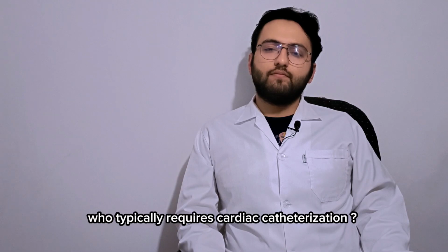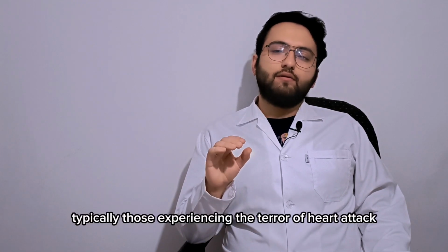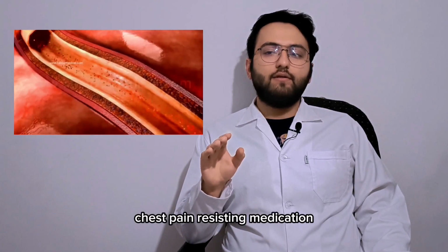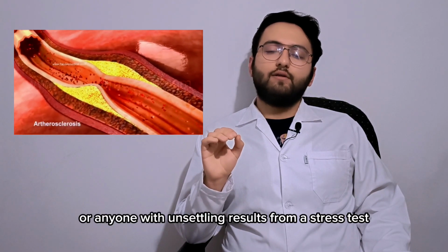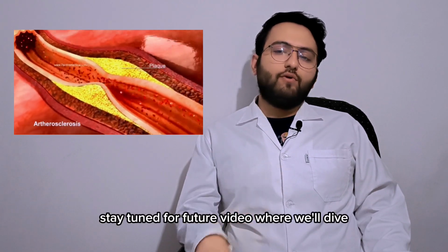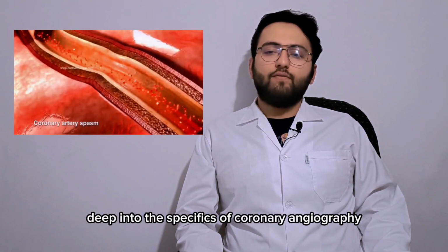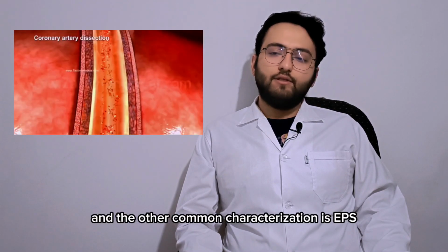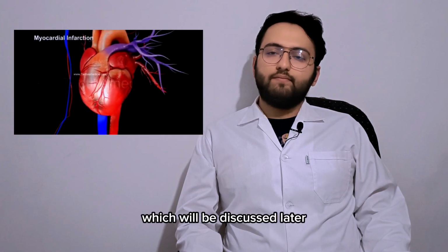Who typically requires cardiac catheterization? Typically, those experiencing the terror of heart attack, chest pain resisting medication, or anyone with unsettling results from a stress test. Stay tuned for a future video where we'll dive deep into the specifics of coronary angiography, and the other common cardiac catheterization procedure is EPS, which will be discussed later.